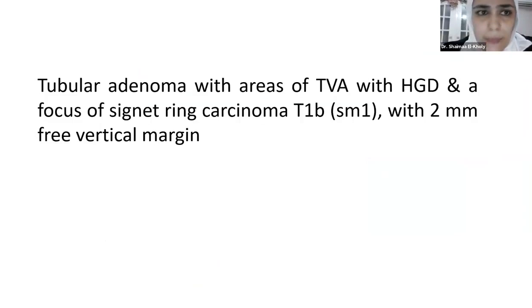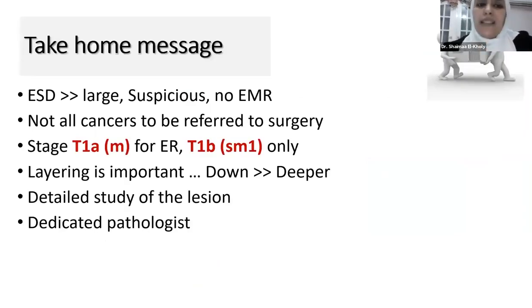So my take-home message is that ESD is for large lesions, suspicious lesions, lesions where EMR cannot be performed. It's no longer the case that all cancers are referred to surgery, because we see a lot of malpractice where patients with carcinoma in situ, after removing it, go for surgery. It's not for surgery from the very beginning.